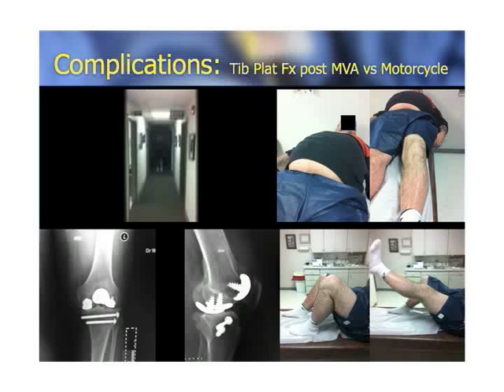This is that patient. He showed up for our follow-up when we started doing the follow-up on our cohort, and all of a sudden I noticed he had two screws here on the tibia that he didn't have before. He said, "Oh yeah, doc, by the way, I was in a motorcycle accident. I was driving 70 miles an hour and a car hit me, and I was taken to the hospital, and I had a tibial plateau fracture. And they did an ORIF, and the guy did a nice job." This is the slides of the patient. You could see him here. This is after he came back from his tibial plateau.